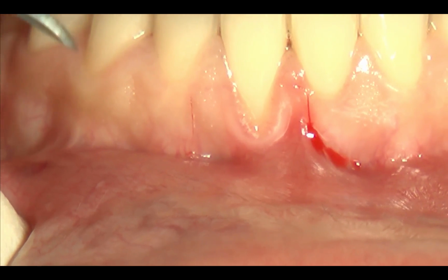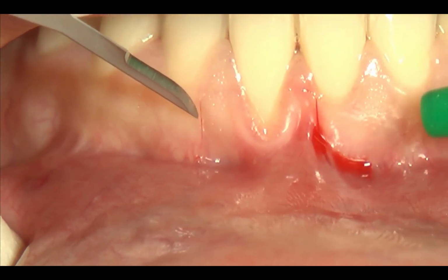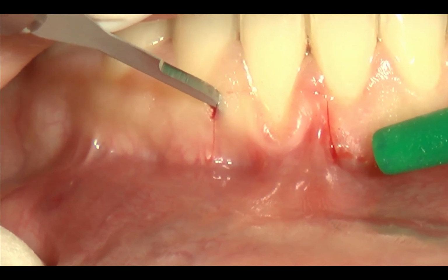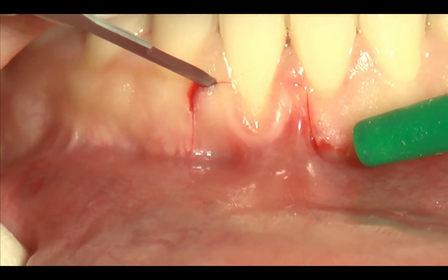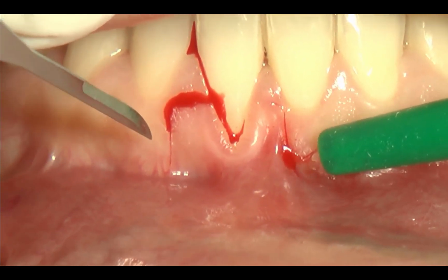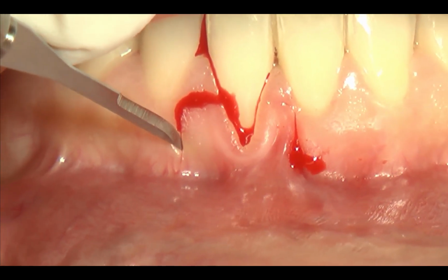Now that the flap design was made, I start with the split thickness elevation at the level of the papilla.